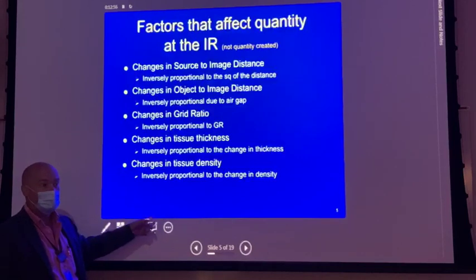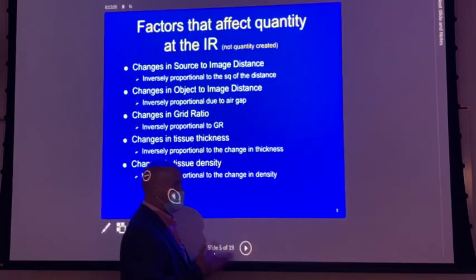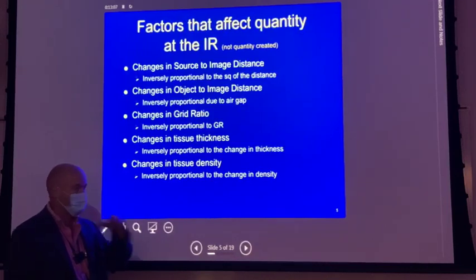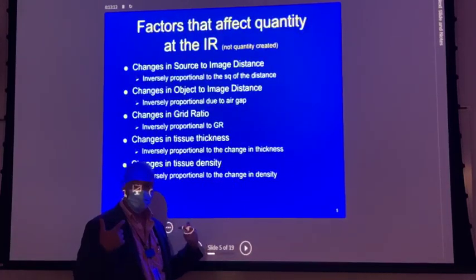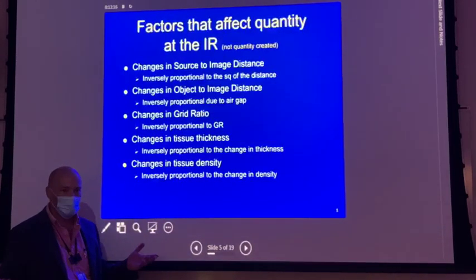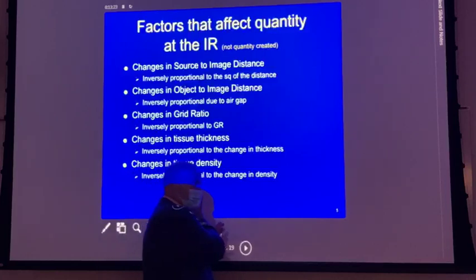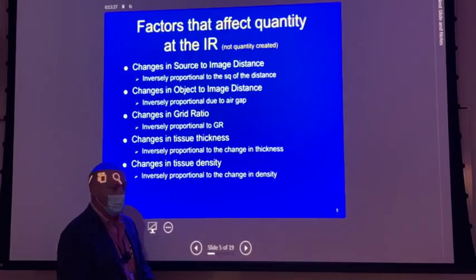Okay. What about the air gap? How can we use the air gap? It makes them miss the. Right, this wide angle scatter radiation will miss the image receptor, so it really wouldn't have much of a place in hand X-rays, but in lateral C-spines, some of your departments, probably little bitty towns, might not use a grid for lateral C-spines because the distance from the shoulder to the C-spine is far enough that you get a natural air gap.